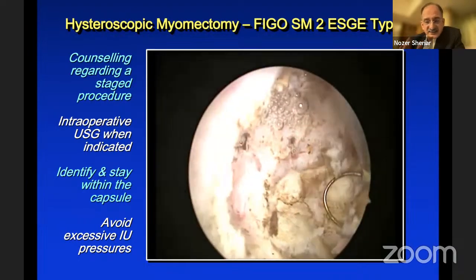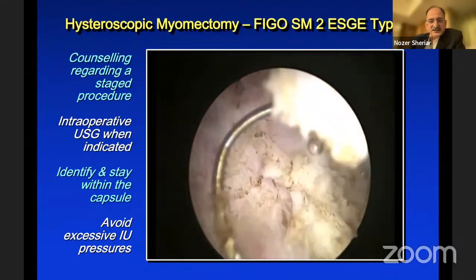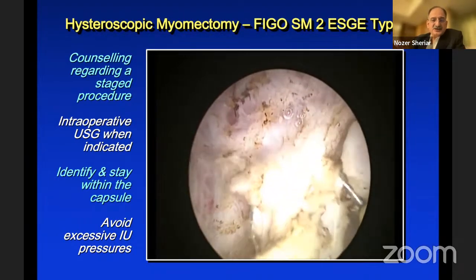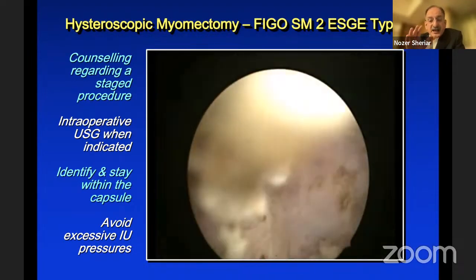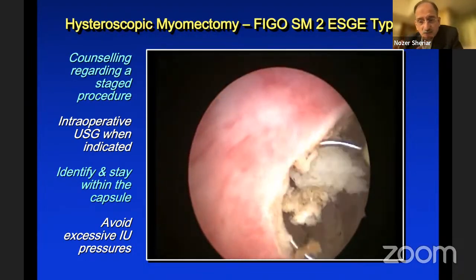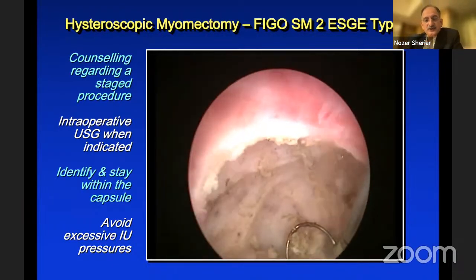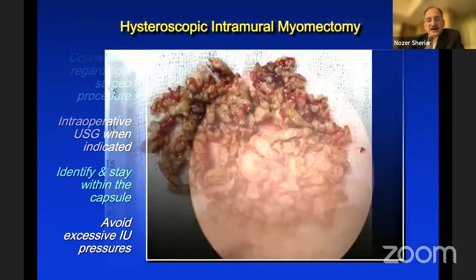And my friends, this is gravity. I'm not using pressure. Okay, I have my Endomat, which I like to use when I'm doing quick stuff like a septum and stuff. When it comes to myomectomy and things that a hysteroscopist should justifiably fear, I've even had an overload with a bipolar resectoscope. You can even have an overload with a crystalloid. So don't think overloads only happen with the other media.